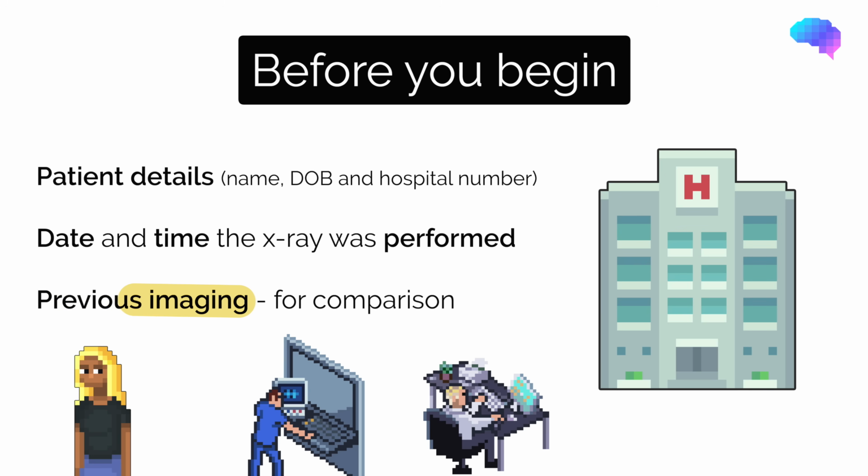As previously mentioned, it's important to understand the clinical context as to why the chest x-ray is being performed. For example, does the patient have any symptoms, such as shortness of breath or a cough? Knowing these details will assist with your overall interpretation and differential diagnosis.